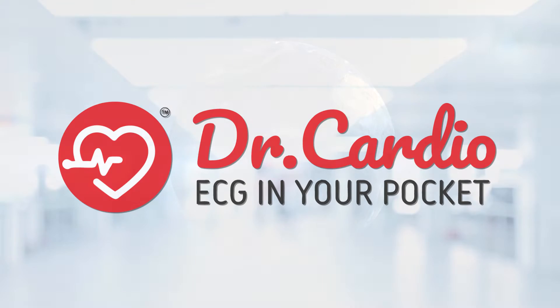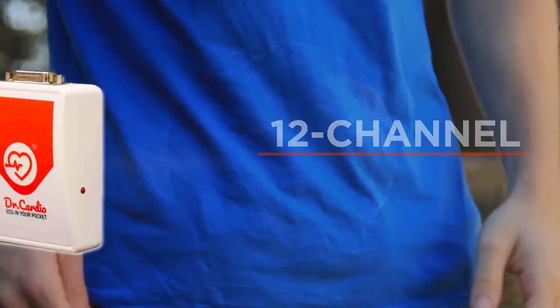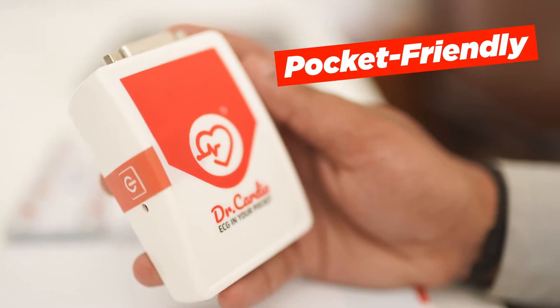Introducing Dr.Cardio, the world's smallest 12-channel ECG machine that fits into your pocket and is pocket-friendly too.